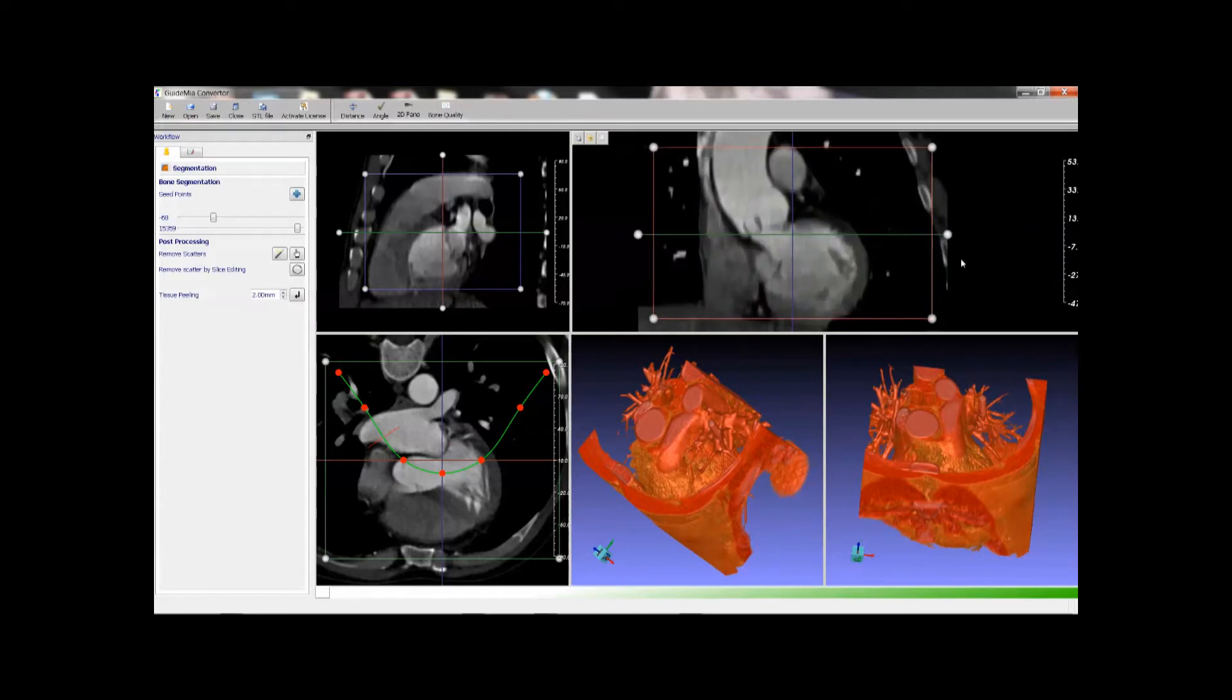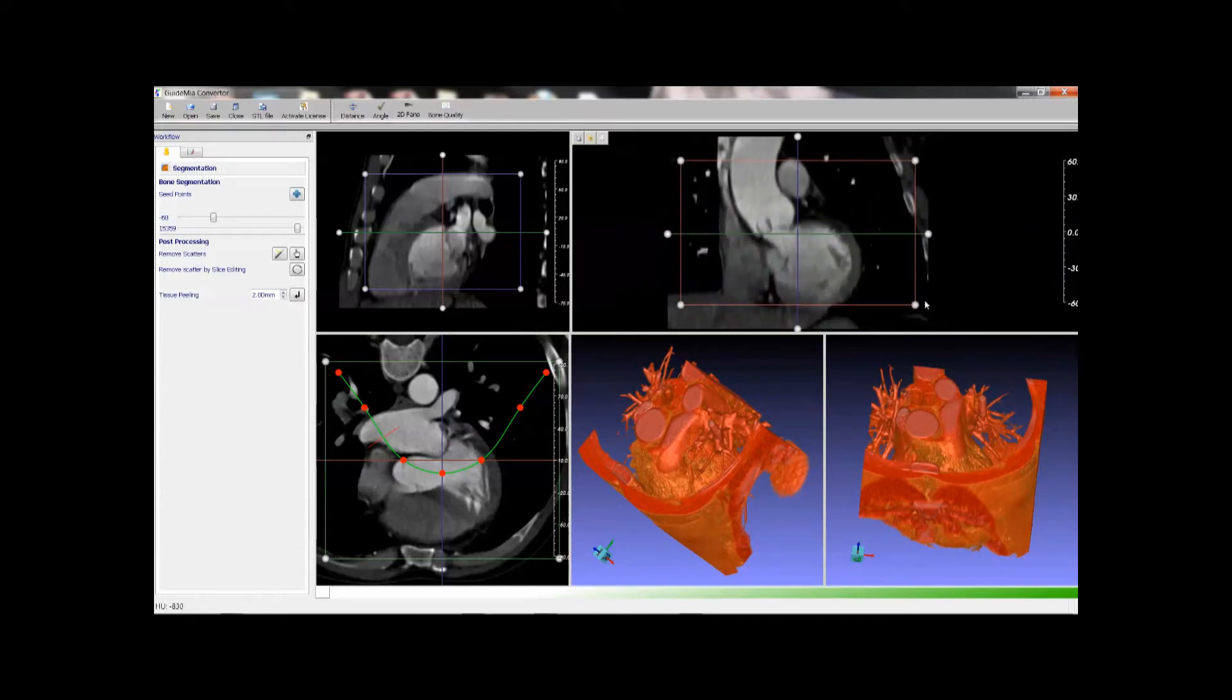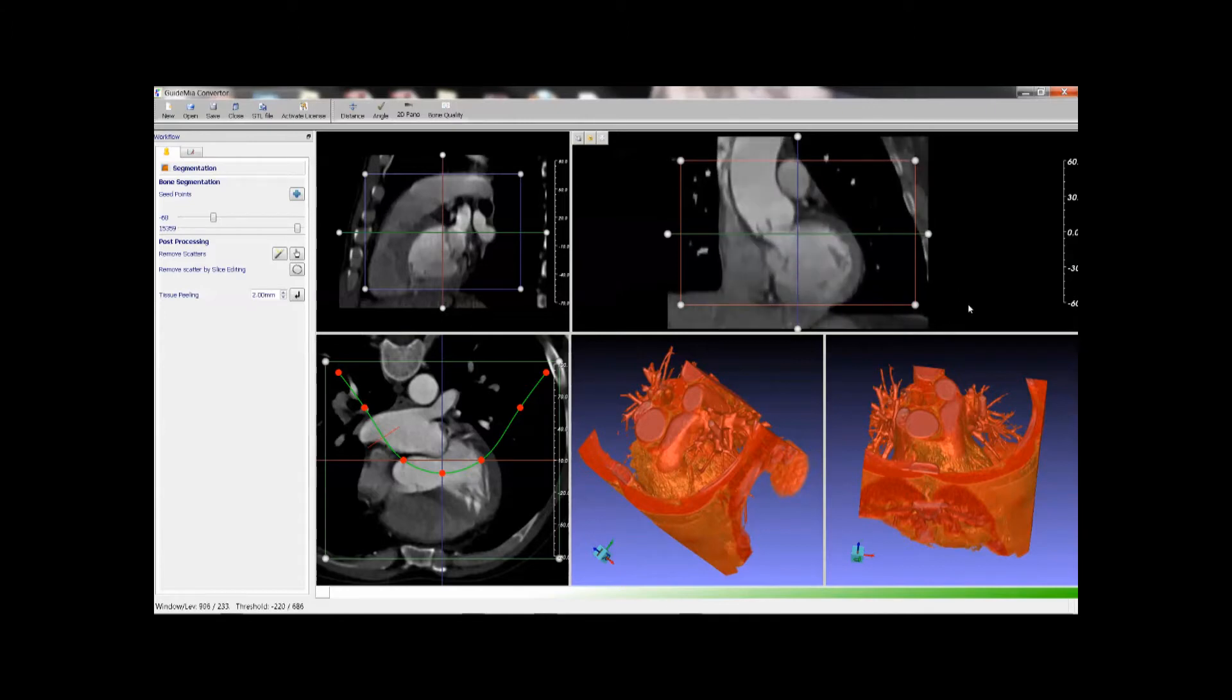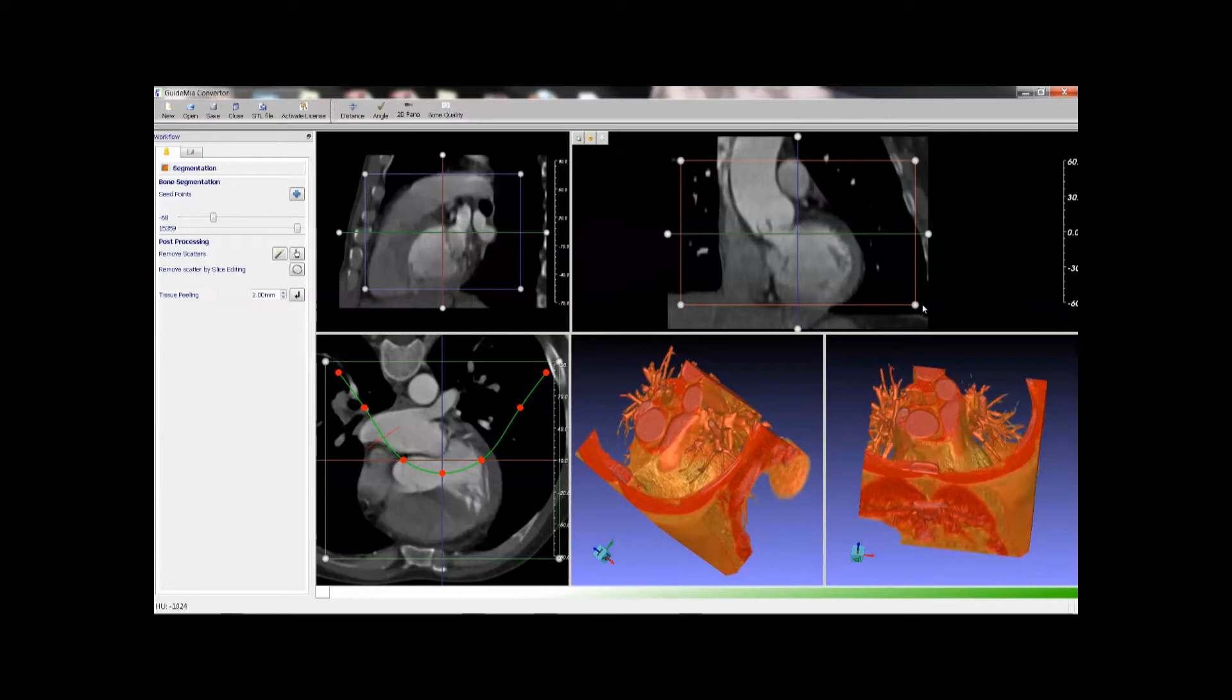Change thresholds in 2D, middle button to move, right button to zoom in and out. 3D views will follow the 2D threshold changes, and the region of interest can be changed by the handles.